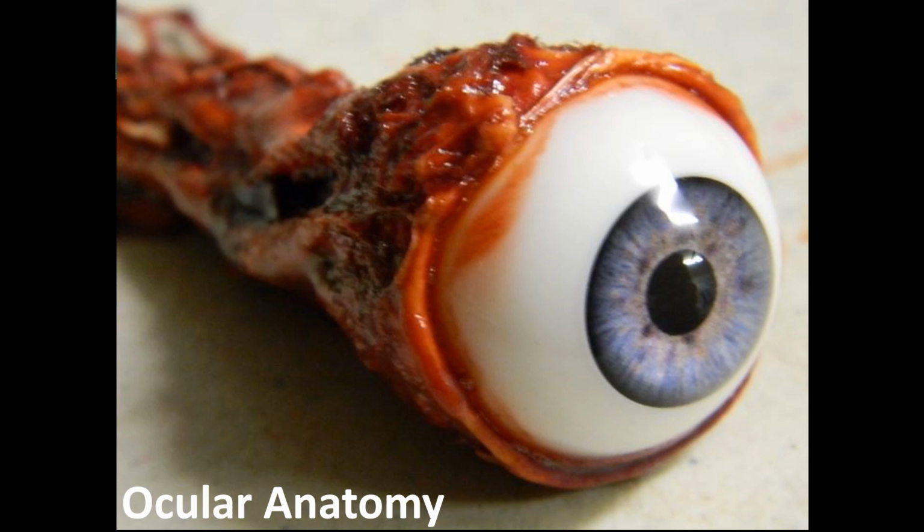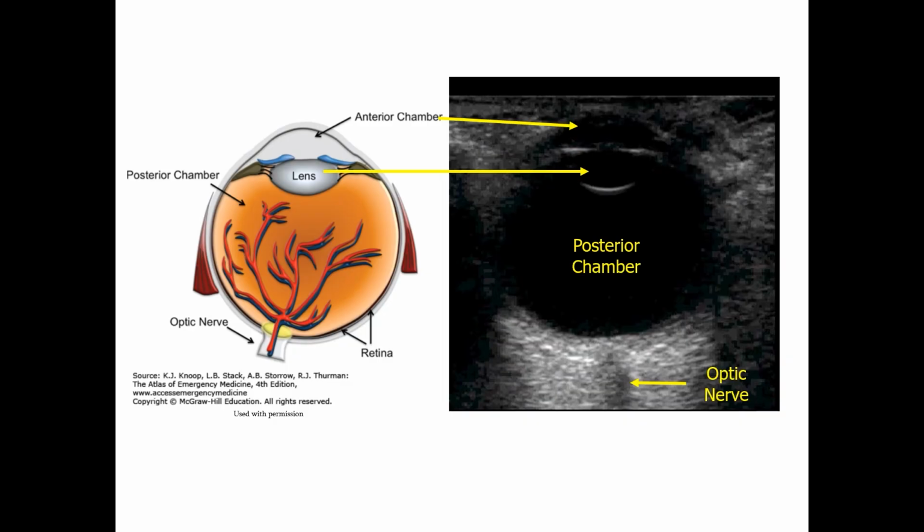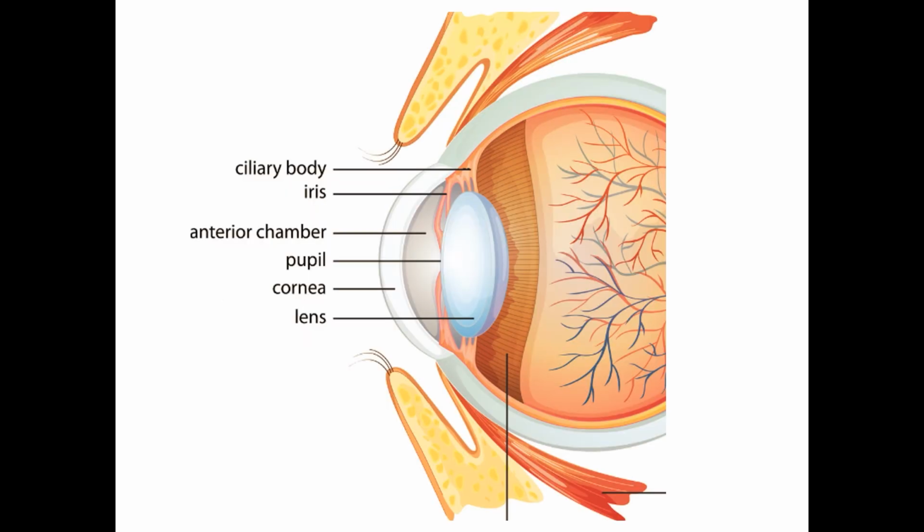All right, so moving on, let's talk about ocular anatomy. And no, that isn't a real eye before people start asking me. It's a nice prop eye, but it's such a good one that I had to include it. So your basic anatomy, we have the anterior chamber, which is filled with the aqueous humor. And then we have the bright line, which is the iris. And then just posterior to that, we have the lens. And so behind that, you have the posterior chamber where you have the vitreous humor, and then the optic nerve is behind that. You can see that as a hypoechoic area in the far field on this image. So just a couple things on the anterior chamber.